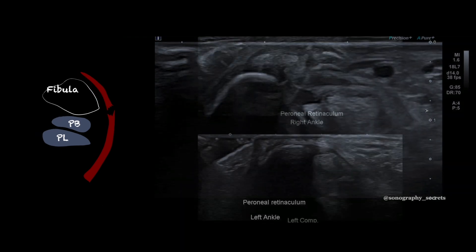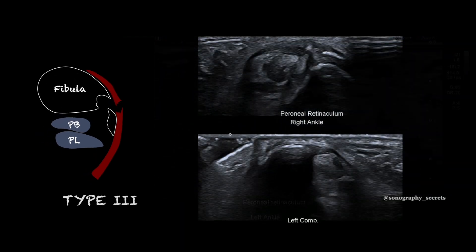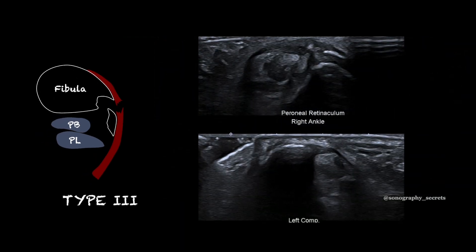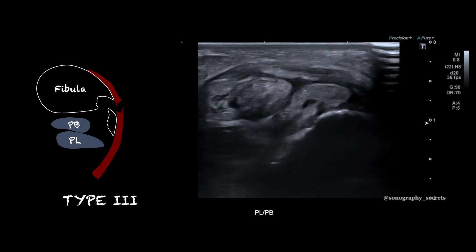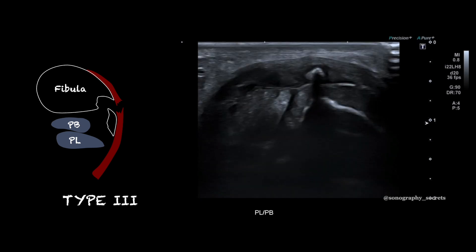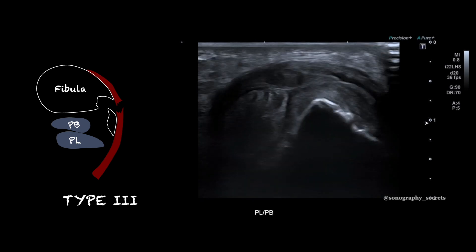Here is an SPR tear with a bony avulsion, and we can see that peroneus brevis has dislocated.